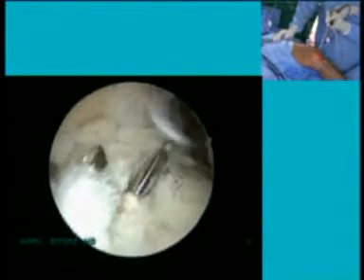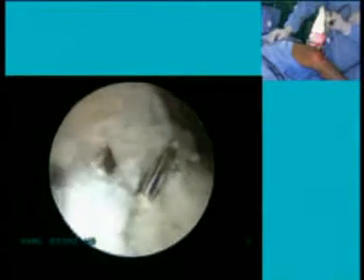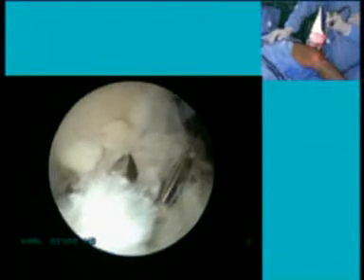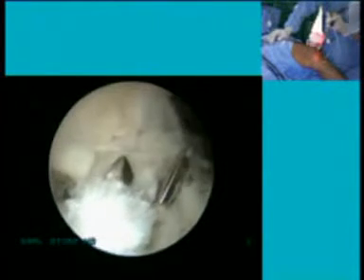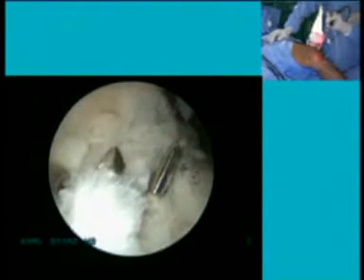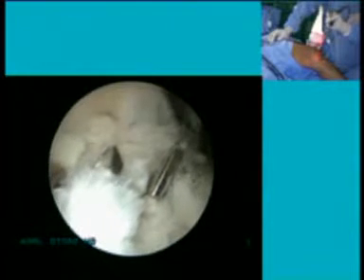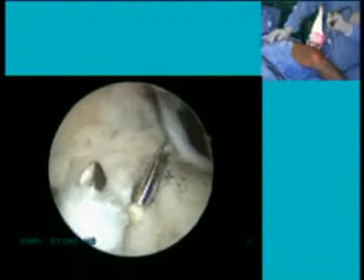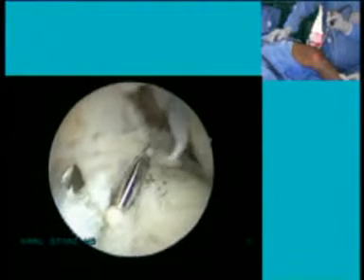Can you give me the 4.5 millimeter drill? Yes, but I correct this tunnel position. It is better than placing a new K wire or guide wire. It's better to correct this tunnel position by eccentric drilling. Okay. So even if the tunnels collide in the tibia, would you be very worried? Is it less of a consequence compared to the femur?